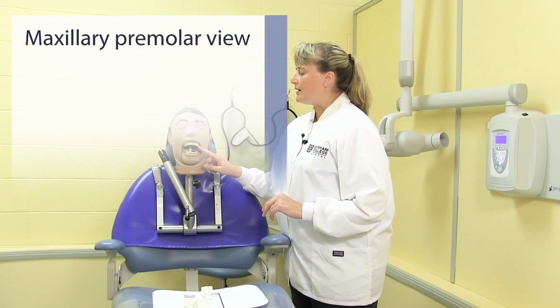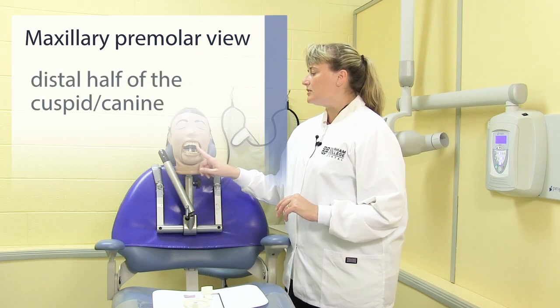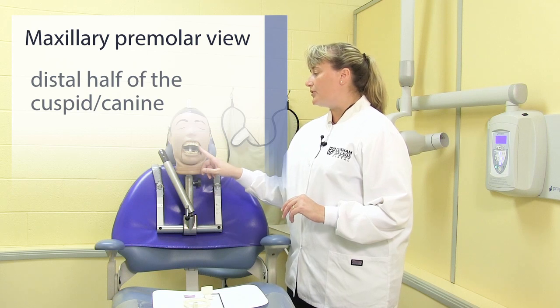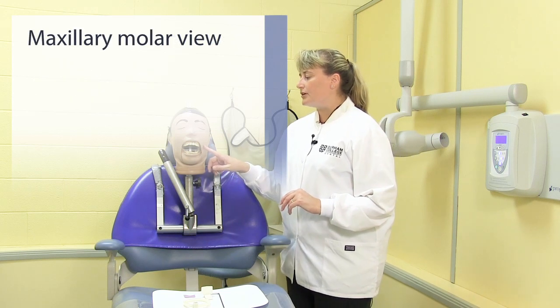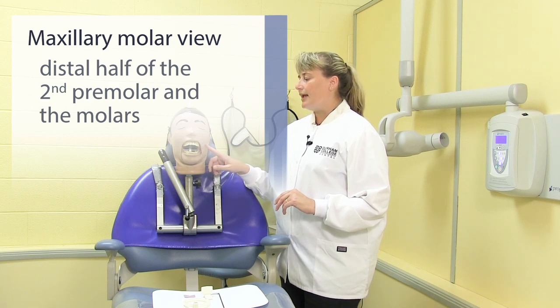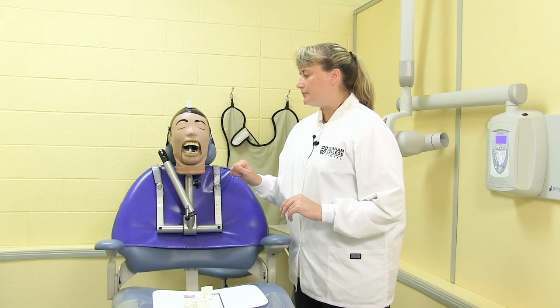We'll start with the maxillary premolar view, and in this shot I will get the distal half of the cuspid or canine and the premolar teeth. For the molar shot, I will get the distal half of the second premolar and the molars. And we do that for each of the 4 quadrants.